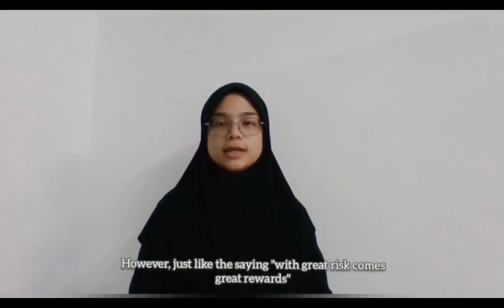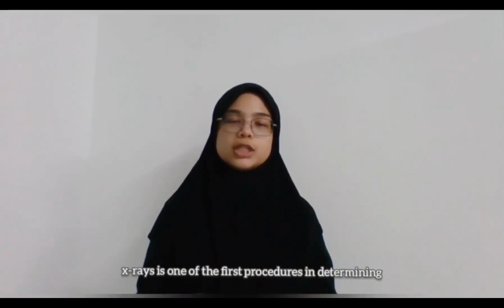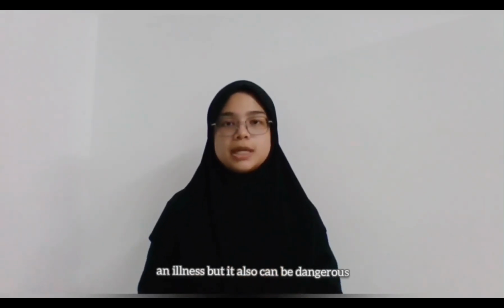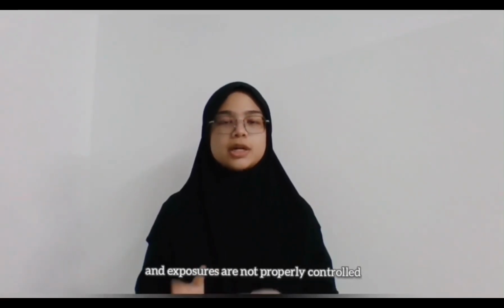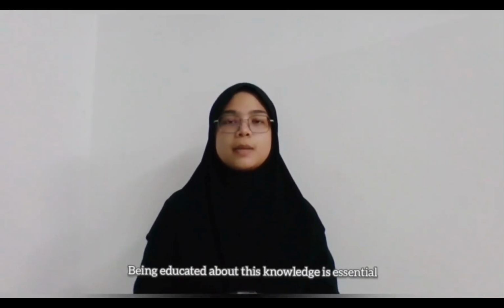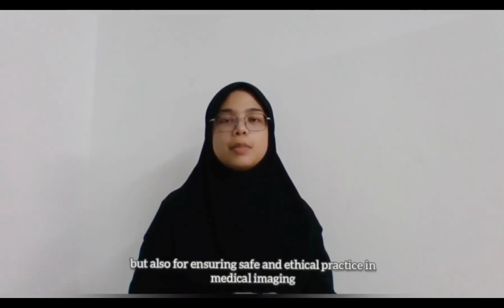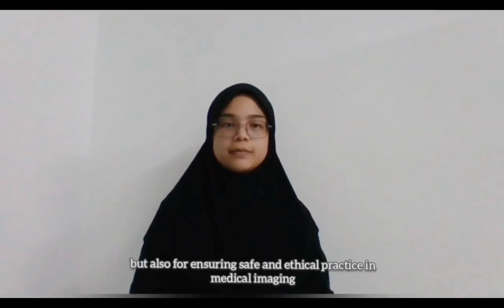However, just like the saying, with great risk comes great rewards. X-rays are one of the first procedures in determining an illness, but they can also be dangerous when X-ray machines are not properly maintained and exposures are not properly controlled. Being educated about this knowledge is essential not only for operating the equipment effectively, but also for ensuring safe and ethical practice in medical imaging.